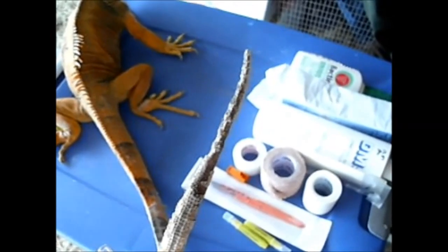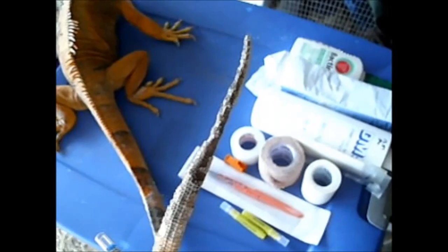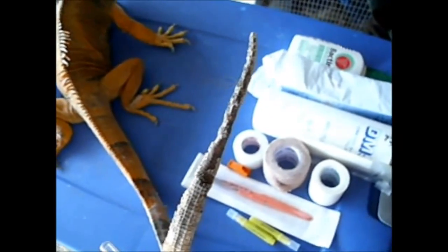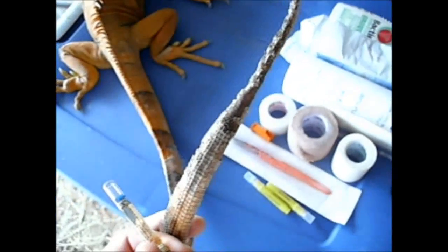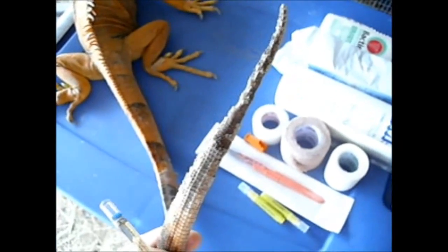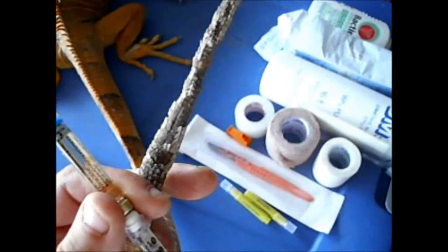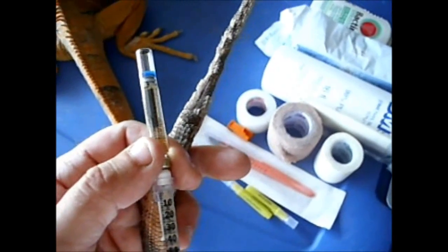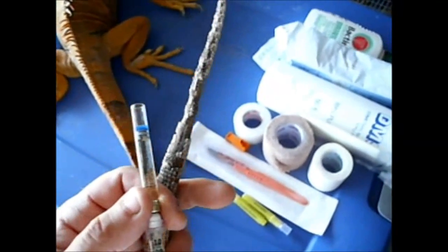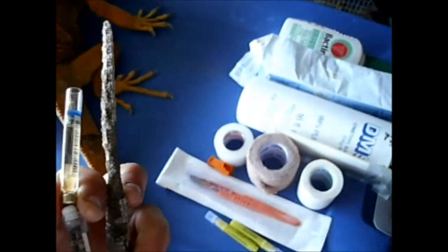But this will reduce the chances that this tissue death here turns gangrenous, necrotic, in other words, and gets infected, and it progresses farther up the tail. So we're going to reduce the chances of that happening by amputating back up here to known viable tissue, and then that should grow back out, and he should be okay.